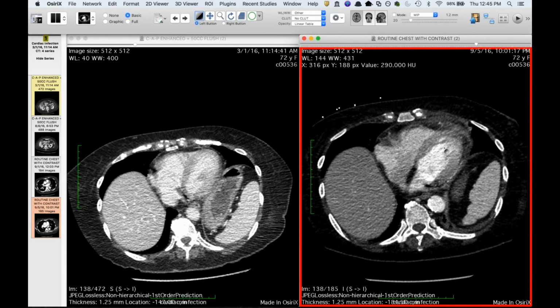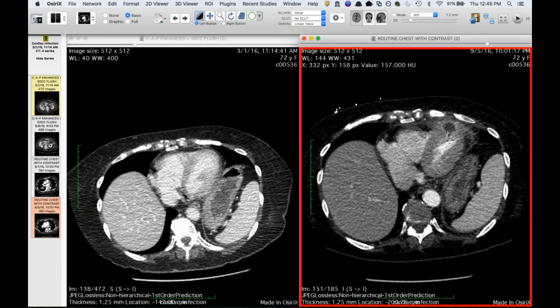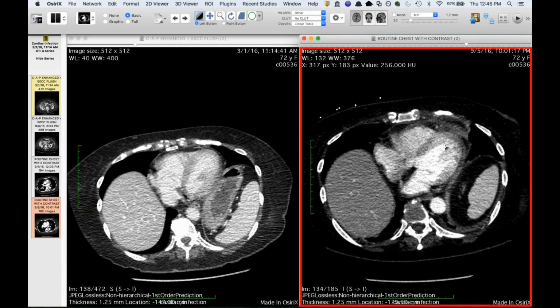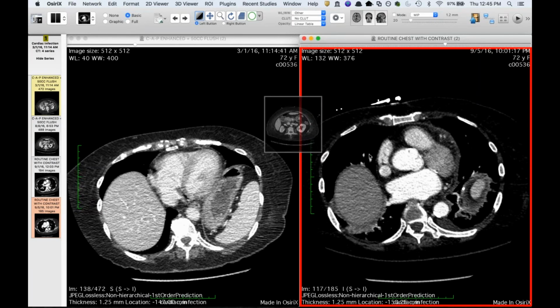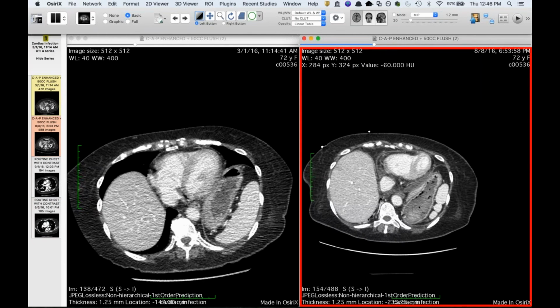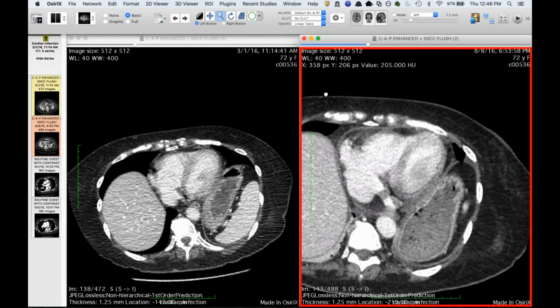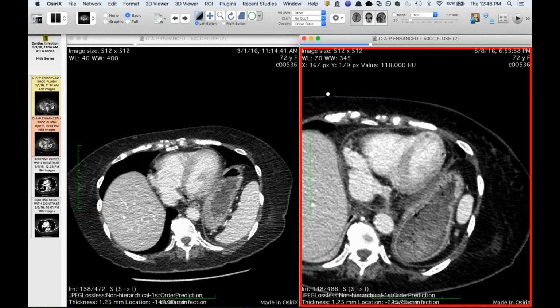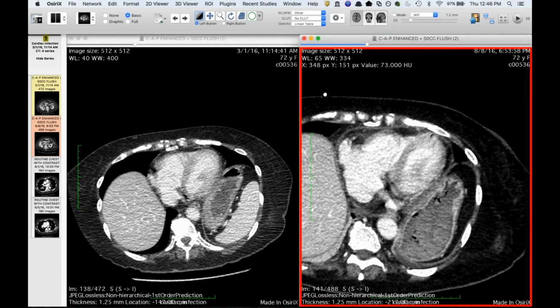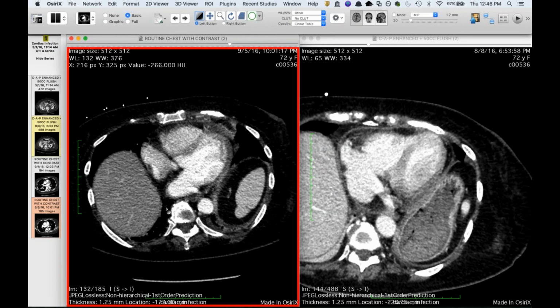So there are cases of purulent pericarditis where you can get more direct, discrete abscess formation like this. So this is what we thought it was, and here it really looks like it's almost taken a chunk out of the left ventricular wall. I show that because this was actually a month before that. This was in August. This was an outside study that she had that they brought with her, and this was a PE study, and I guess this was not detected at the time, but you can kind of see the start of this, and it looks like there may be some just low attenuation in the wall of her myocardium. This may have been a hematogenous seeding of this area that then evolved into this just ugly looking purulent pericarditis.